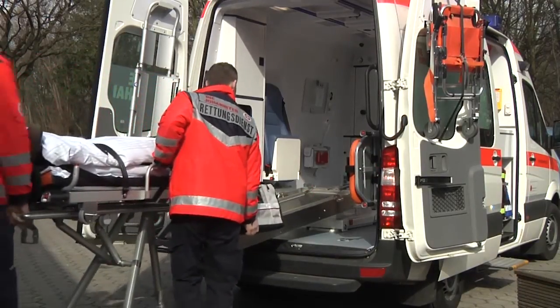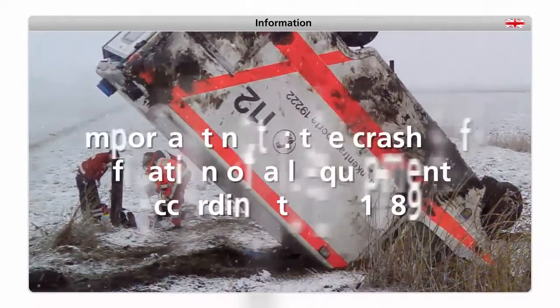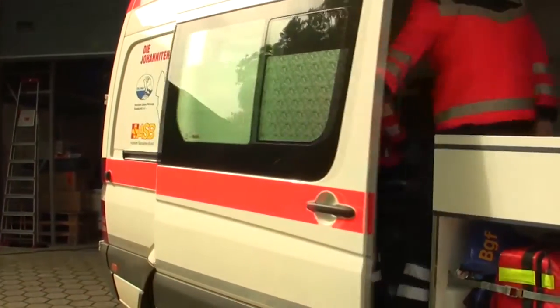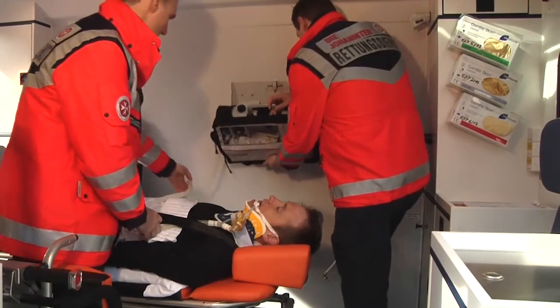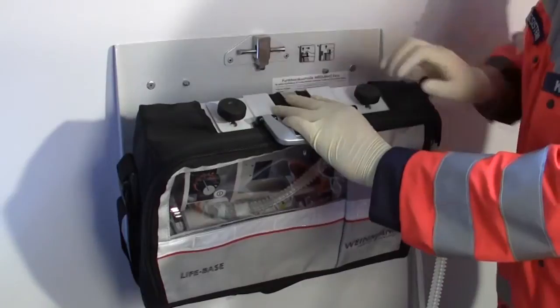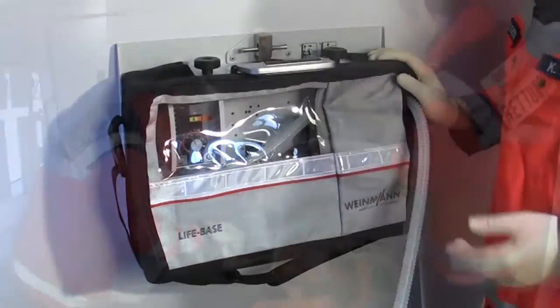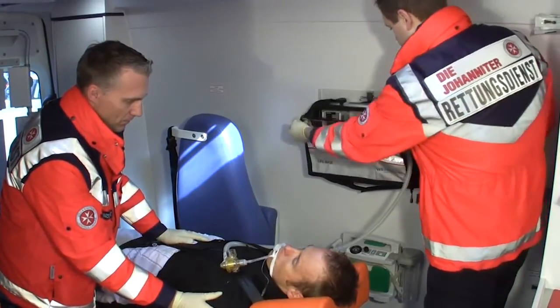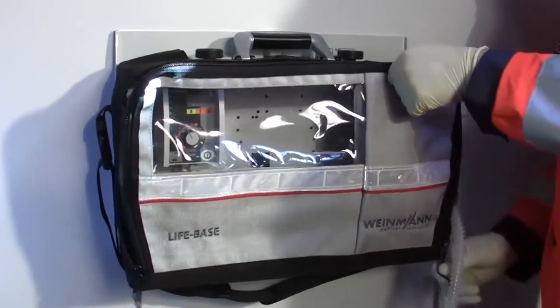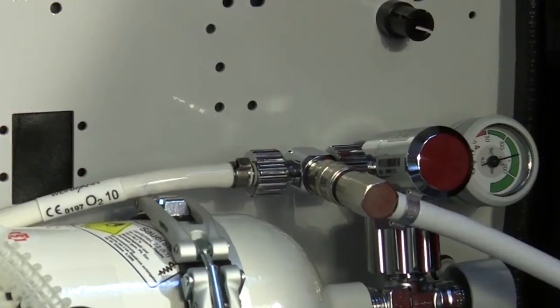As soon as the patient has been loaded into the ambulance, all equipment and medical products are to be secured so that they are crash resistant. In the event of sudden braking or a vehicular accident, unsecured objects can become dangerous projectiles that can seriously injure medical personnel and the patient. For crash-resistant storage of LifeBase 3, the wall mount Base Station 3 NG is permanently screwed against the ambulance vehicle's wall. Before you put the LifeBase 3 into the wall mount, you must retract the clamp. Make sure that the red button on the release pin does not protrude from the release housing. To ensure mobility, switch to the ambulance's stationary oxygen system as soon as the LifeBase 3 has been placed in the wall mount.